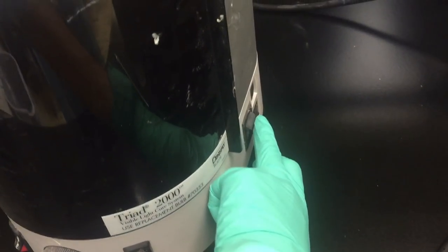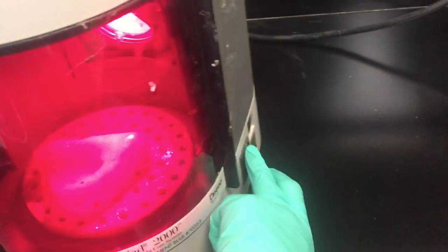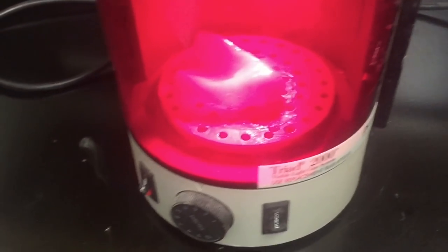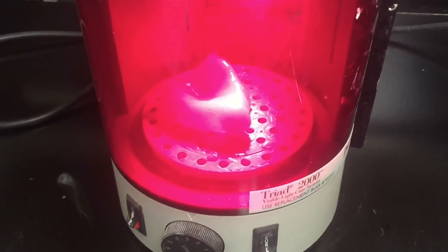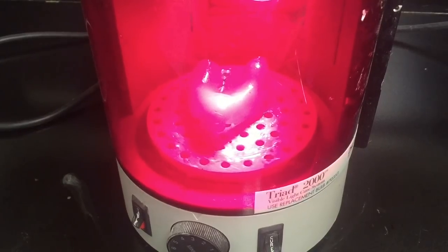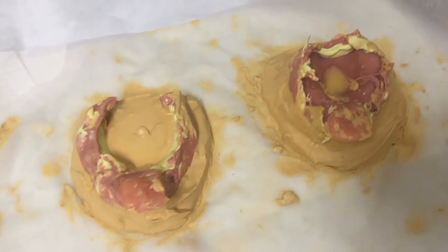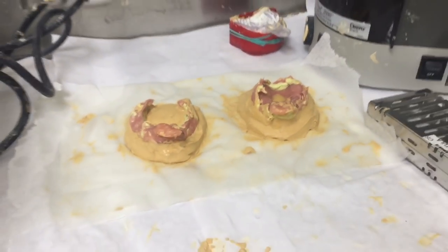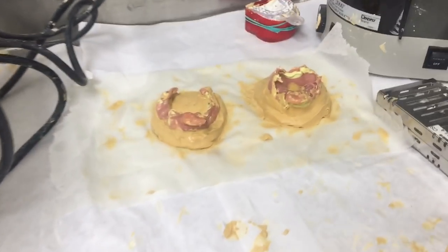The reason we make custom trays is to create a master impression, which is the final impression used to make the denture base. Alginate impressions don't capture the mouth as accurately, so we need these custom trays that fit better inside the patient's mouth in order to create that final master impression.